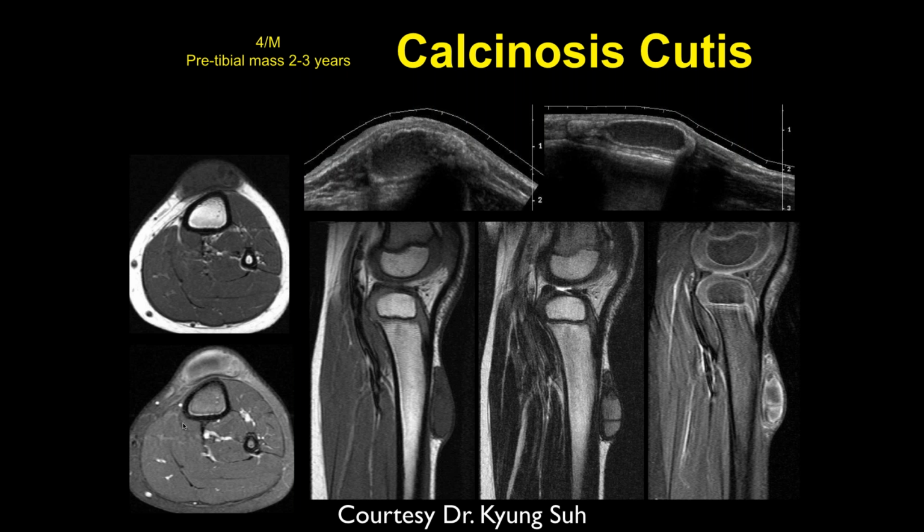So for this case, as we said, trauma, if it's a trauma, can we put like Morel-Lavallée kind of lesion, like more of a shear injury to the anterior? A Morel-Lavallée injury, you would have to see fluid and you have to see really a separation at the deep fascia of the skin. And a lot of fat and blood. But this doesn't look like any of that. This potentially could be a chronic lesion later on.